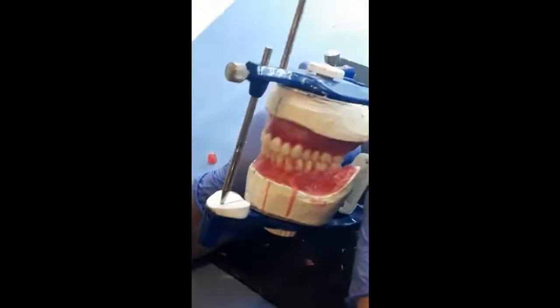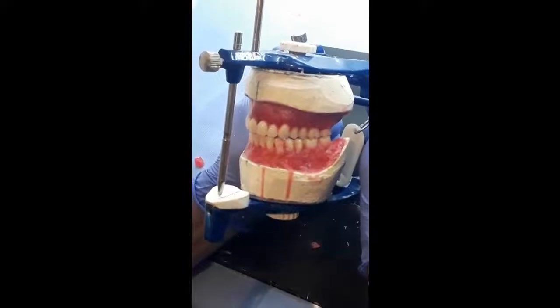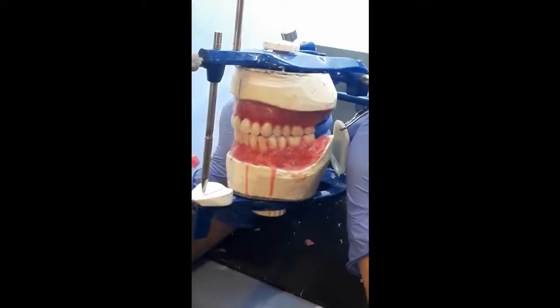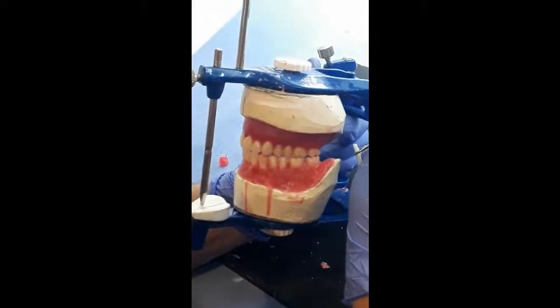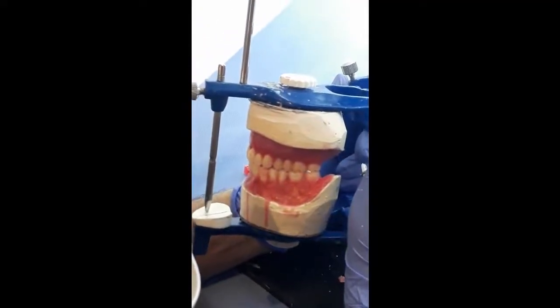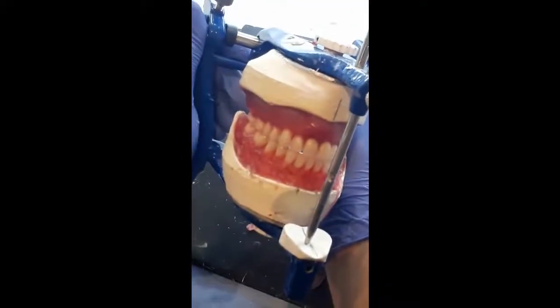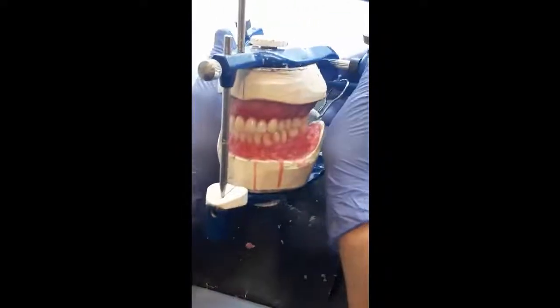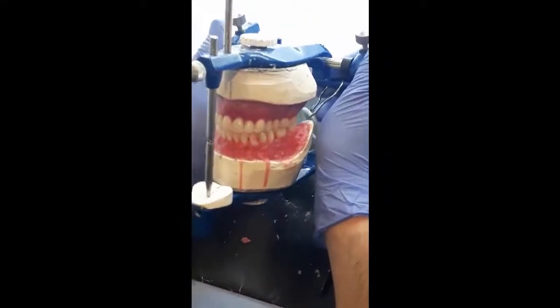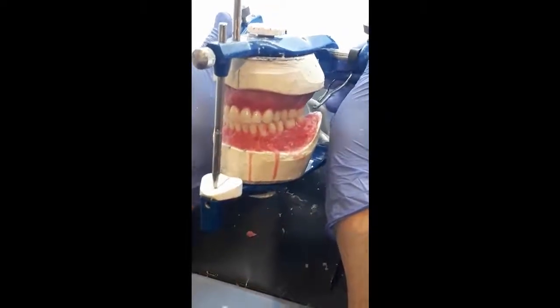Now if I move the articulator to the opposite side, we have here the working side now, and we have multiple contacts in the working side, and we have multiple balancing contacts without the separation of the incisal pin. Now this is what we are planning to do in order to achieve balanced occlusion.